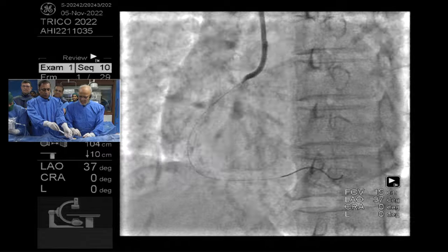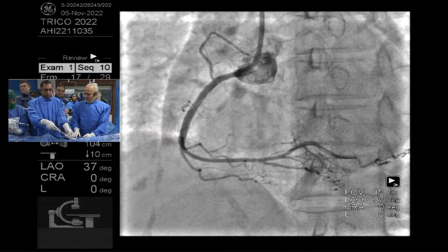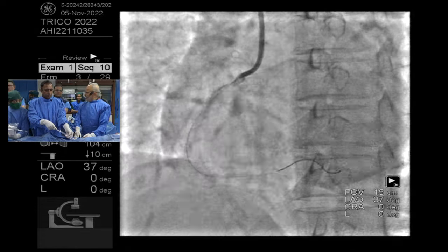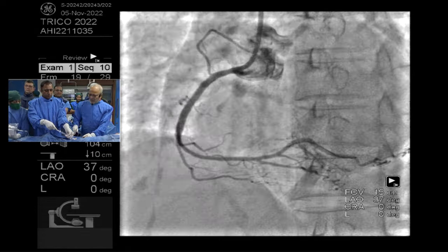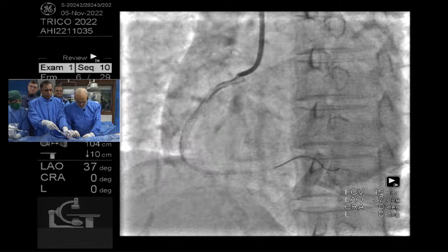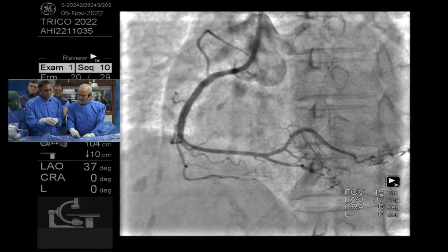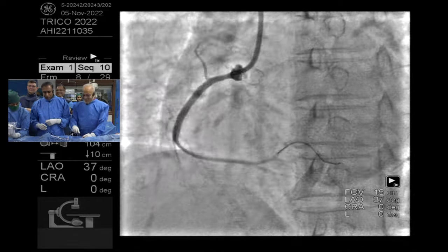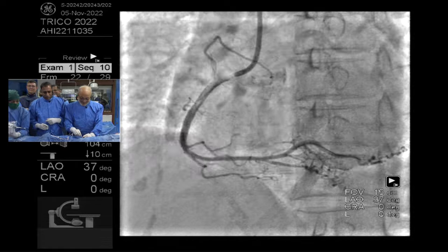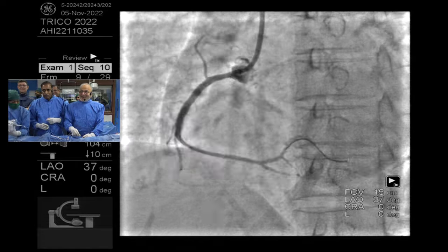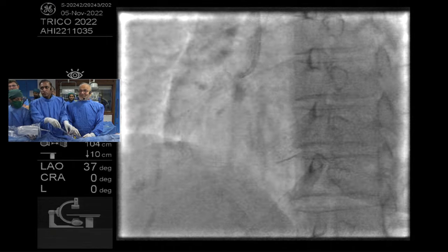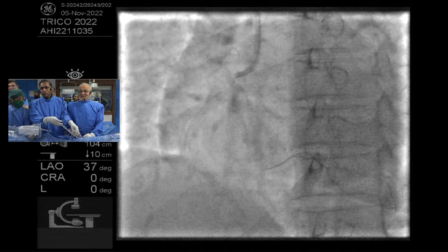If I had been in the US, I think the authorities would have kicked me out before 10 years — because unfortunately I have to work with these low radiation values. Now you — I like it, that's why I work this way.